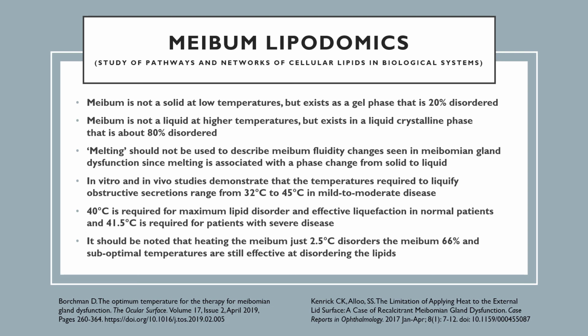I don't want to say anybody is trying to be purposefully inaccurate, talking to a bunch of optometrists and ophthalmologists trying to sell some technology. But there has been, in my opinion, a little bit of an overreaction to some of these metrics, where manufacturers try to take these numbers and twist them, so to speak, to make their technologies appear to be superior.